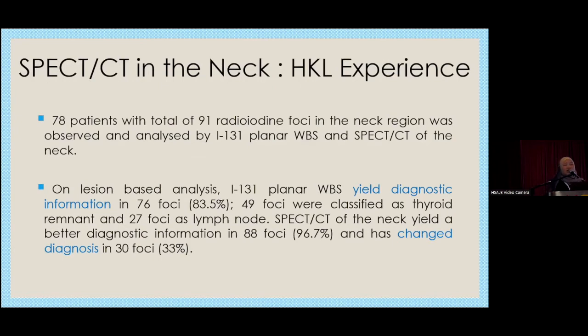Now, how about the HKL experience? We do have a lot of cases, but I'm glad that we have one study looking at 78 patients doing SPECT-CT in the neck region. It detected about 91 radioiodine foci in the neck region, and we analyzed the area comparing planar as well as SPECT-CT.